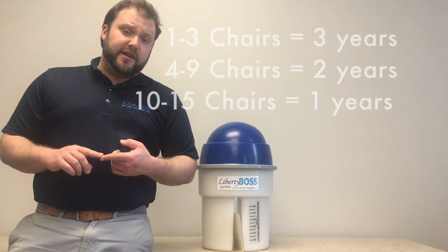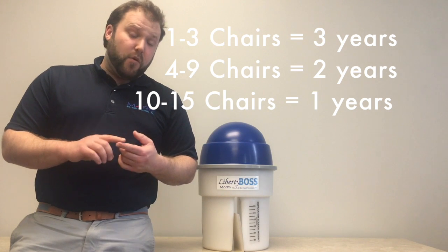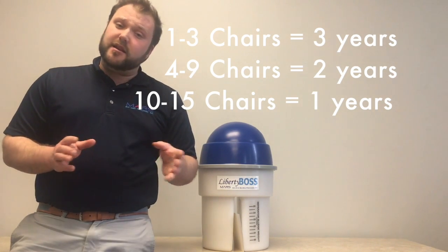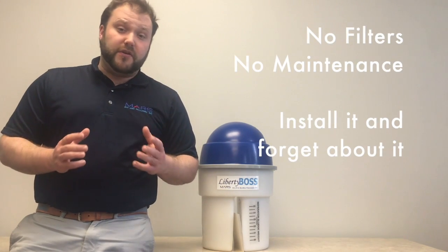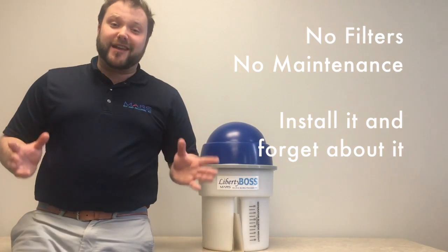A one to three chair practice, a Liberty Boss will last three years. A four to nine chair practice, a Liberty Boss will last two years. A ten to fifteen chair practice, a Liberty Boss will last a year. There are no filters, there is no maintenance — you just have the system installed and then forget about it.